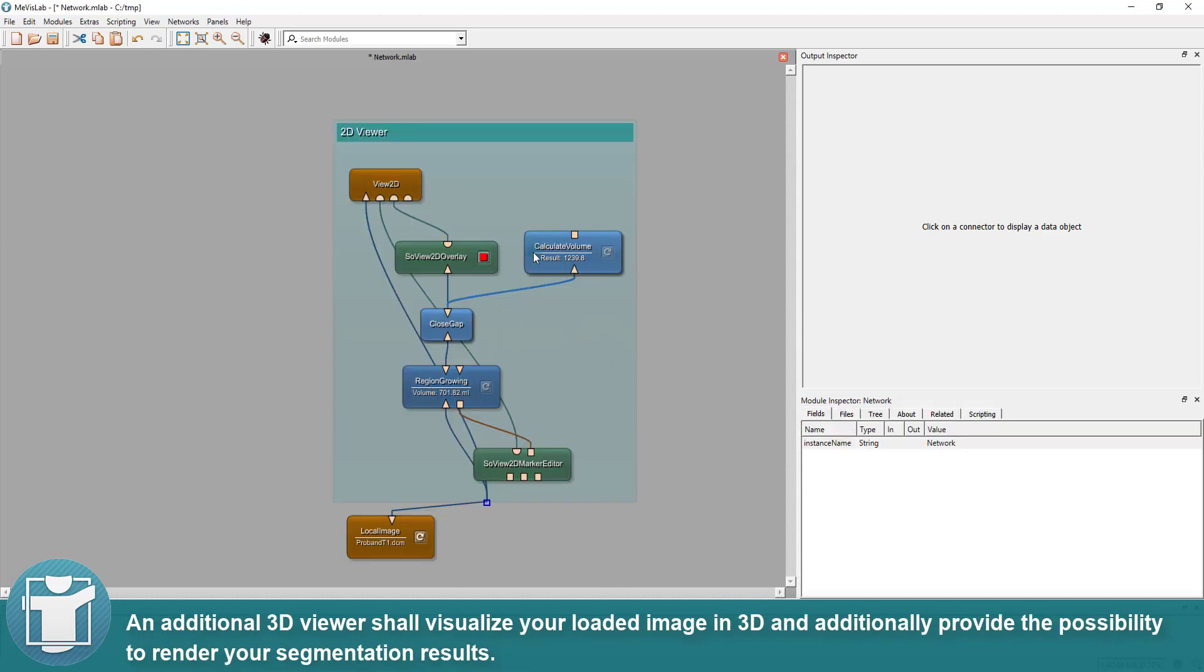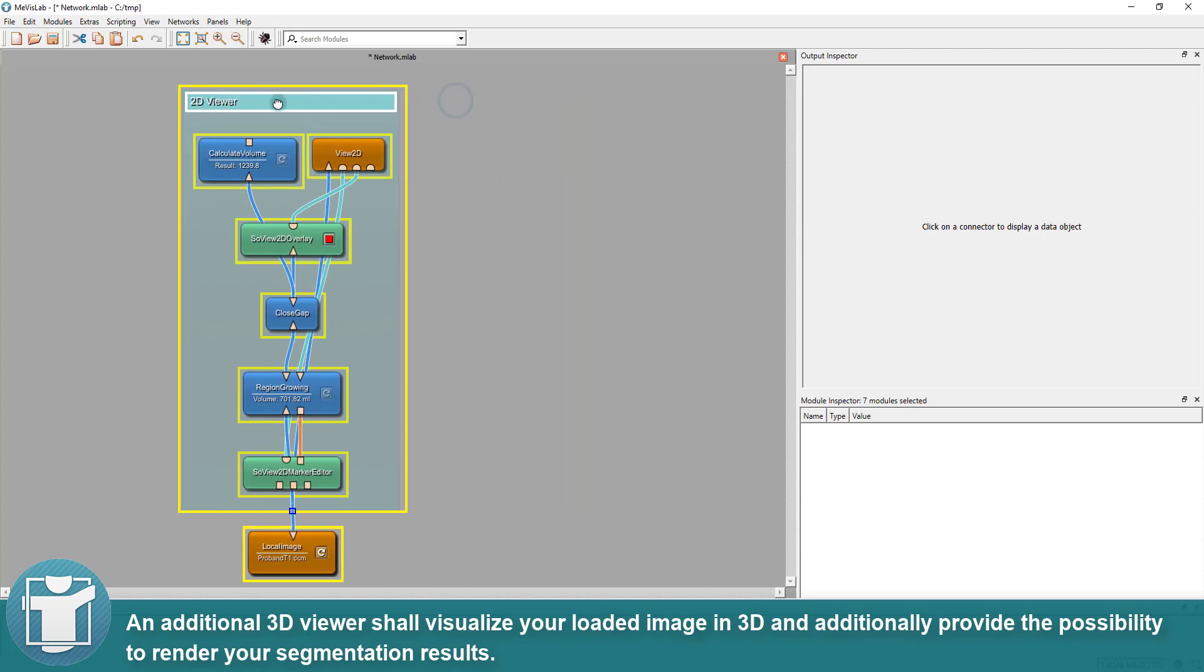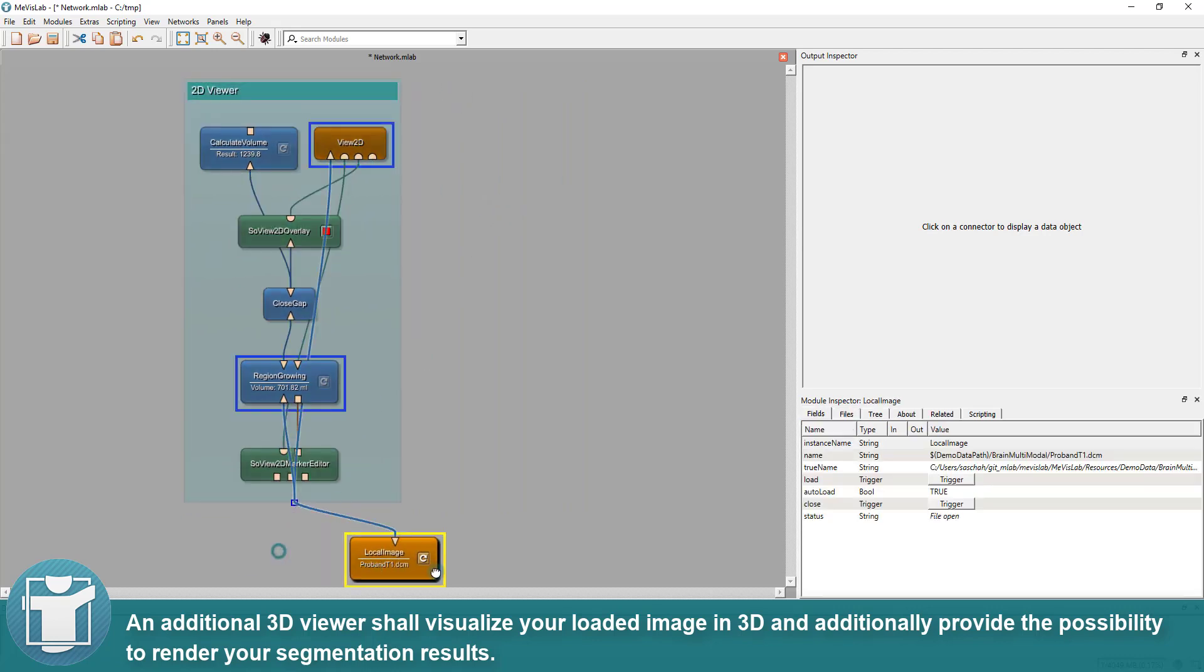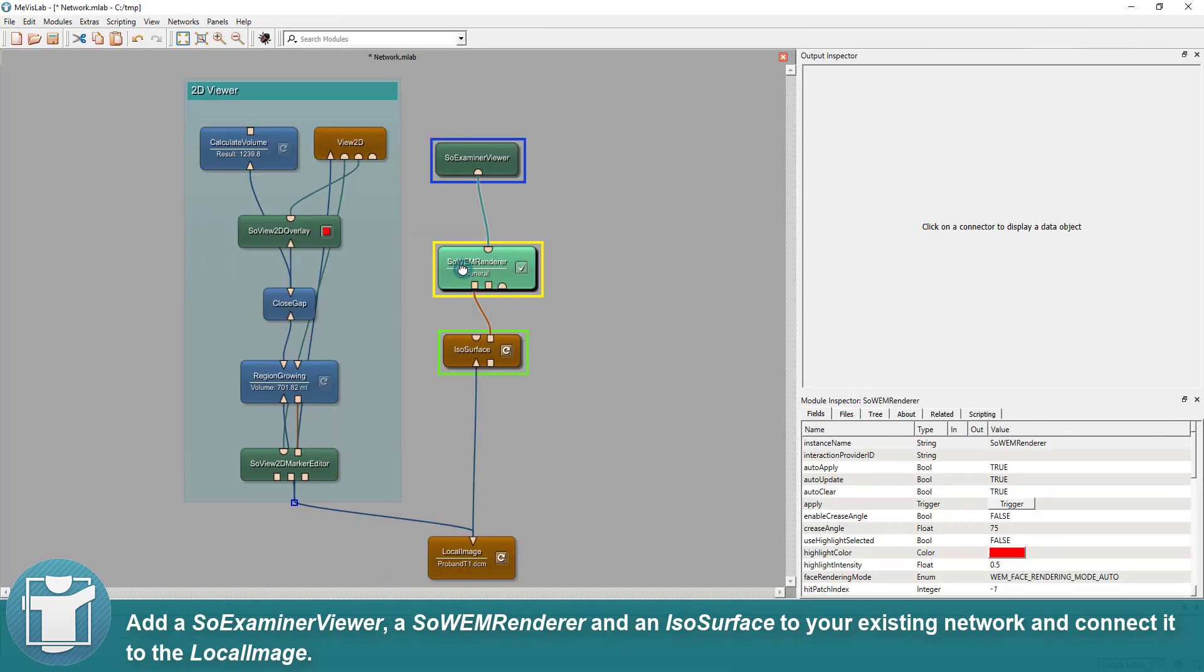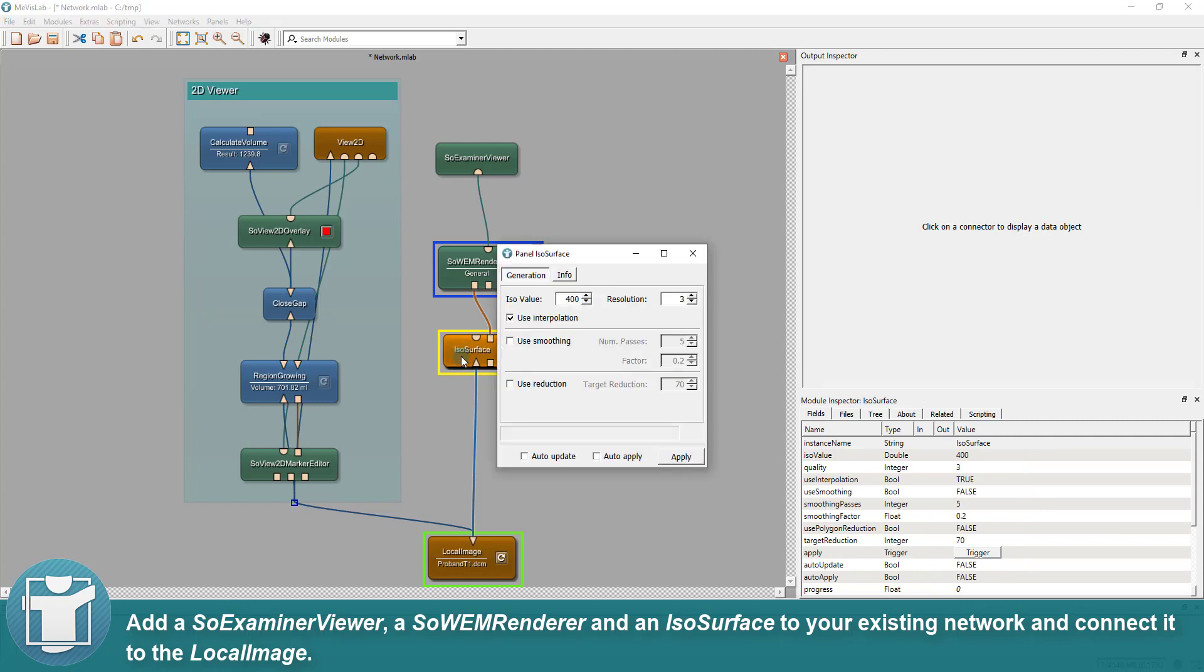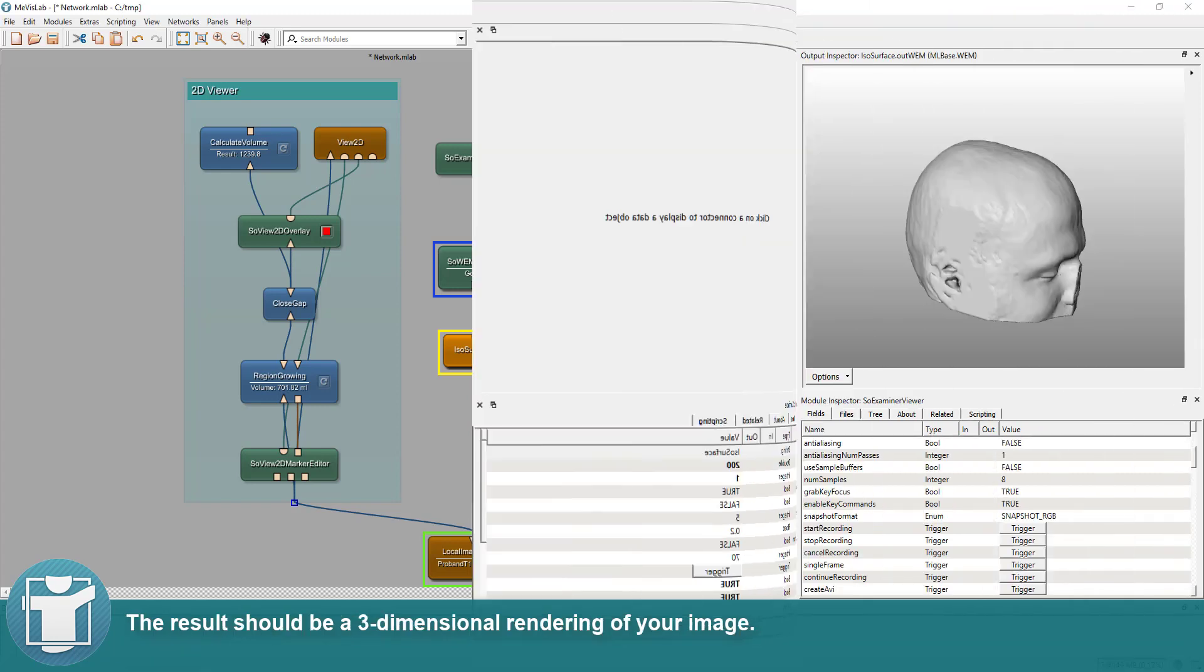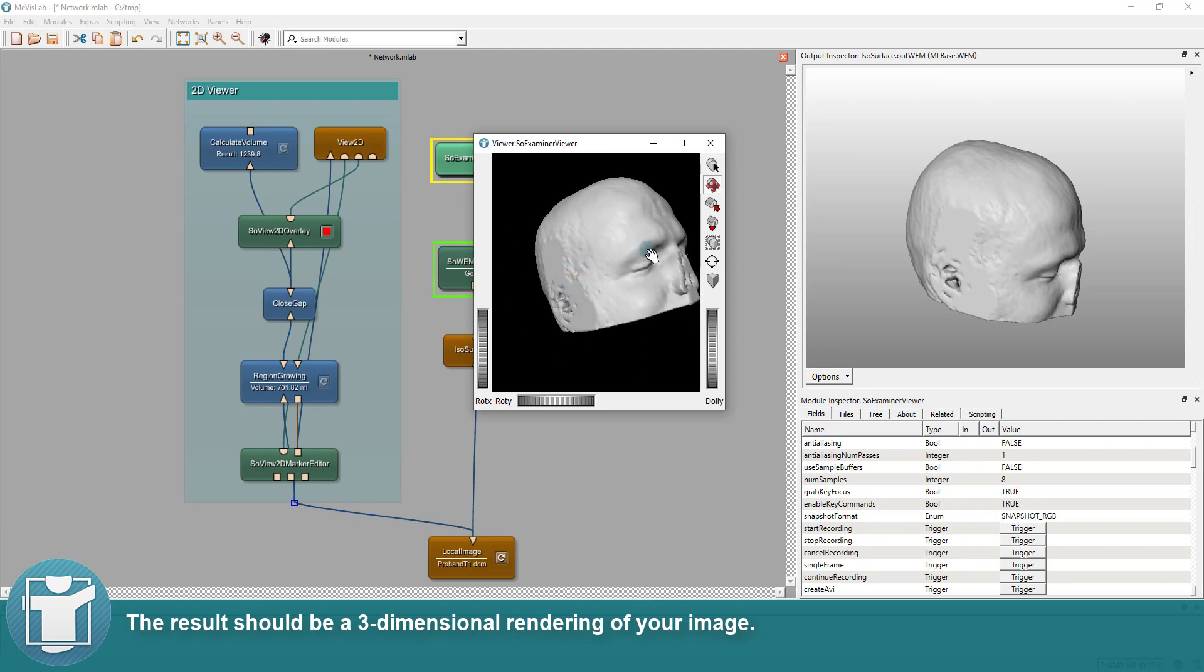An additional 3D viewer shall visualize your loaded image in 3D and additionally provide the possibility to render your segmentation results. Add a SoExaminerViewer, a SoWEMRenderer and an ISO surface to your existing network and connect it to the local image. Configure the ISO surface to use an ISO value of 200, a resolution of 1 and check auto-update and auto-apply. The result should be a three-dimensional rendering of your image.